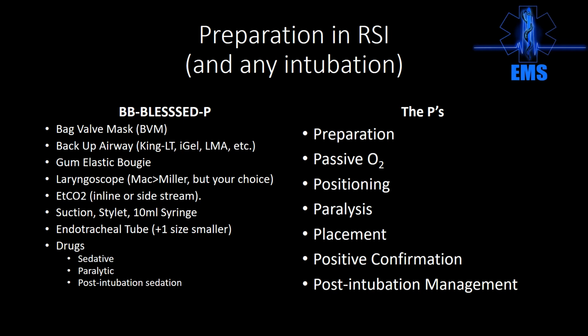Positioning. Recall what I said about the external auditory canal being in a parallel line with the sternal notch and the head being at 30 degrees. If you put the patient in that position, you're more likely to have a first pass success. Now we're in it to win it.